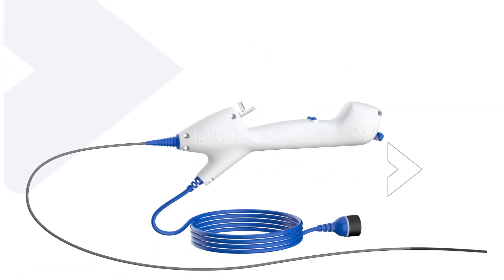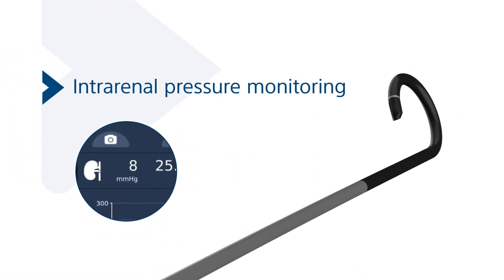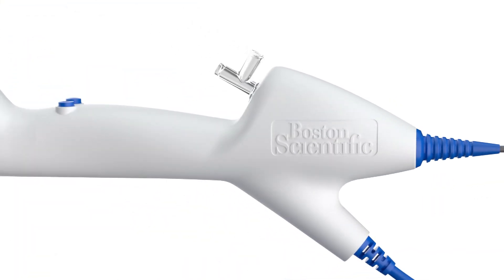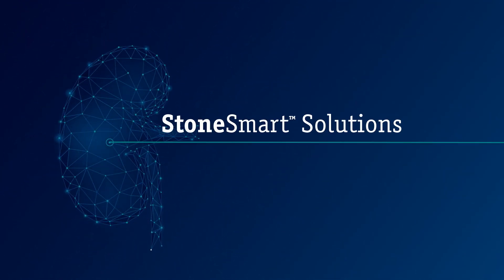The Lithaview Elite ureteroscope is the first and only flexible ureteroscope with intrarenal pressure monitoring, giving you the power to make informed real-time clinical decisions. The Lithaview Elite system is the first device designed on Boston Scientific's next-generation Stone Smart technology platform.